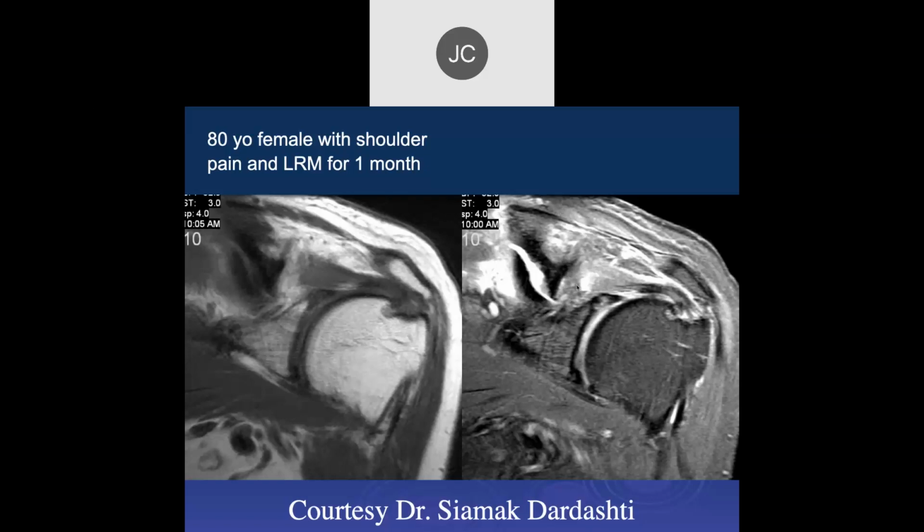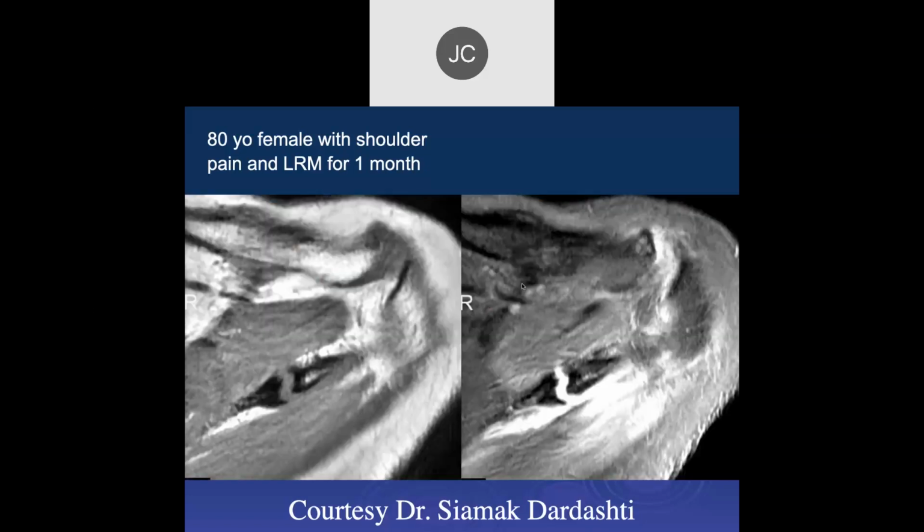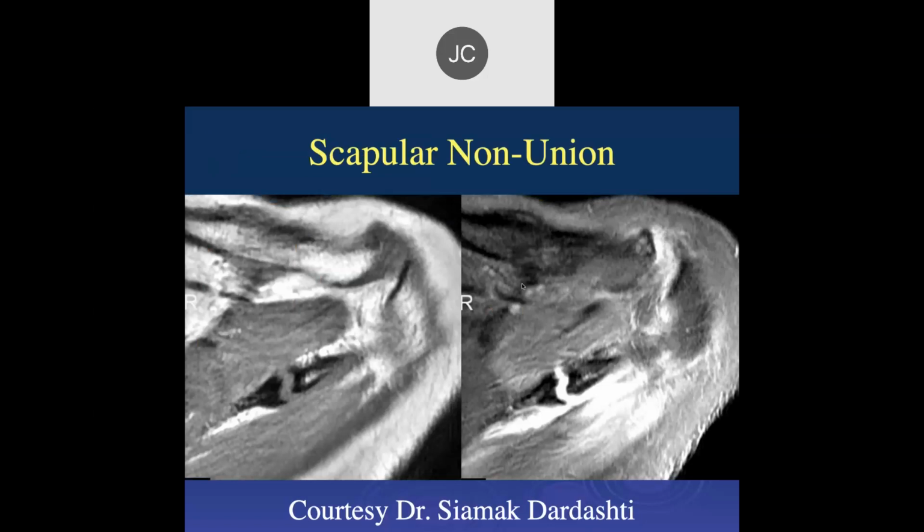It's just that, with your usual way you scan images, people don't spend a lot of time and effort on the scapula here proximally. Most of the business we look at is over here. But just remember that for chronic pain syndromes, you can have scapular fractures, and they're uncommon, but they're not rare.